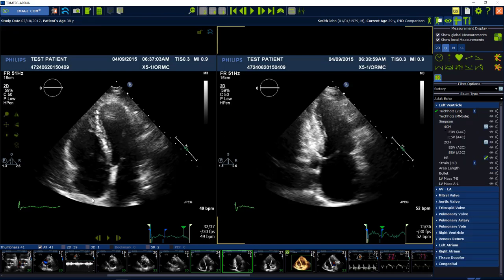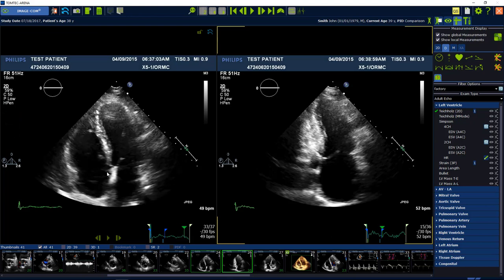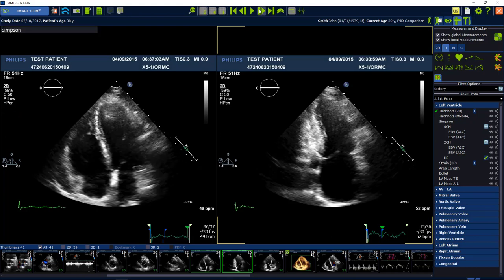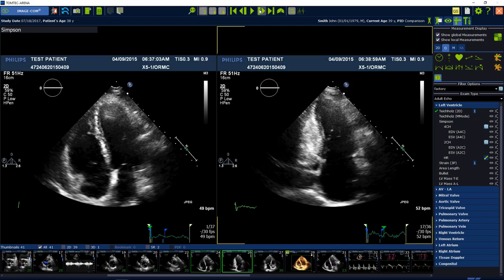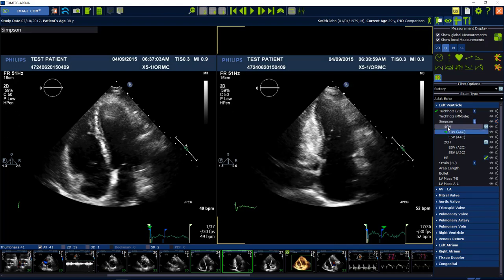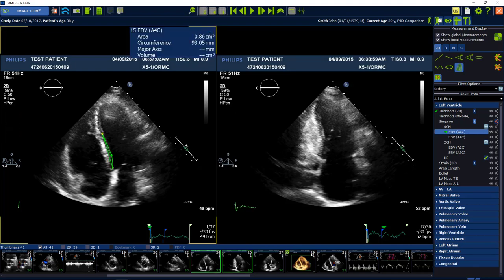Select the end diastolic volume for the apical 4 chamber view from the measurement menu and choose the end diastolic frame by using the mouse scroller. Place the first dot into the image at the mitral valve annulus and set supporting points along the endocardial wall by using left mouse clicks.